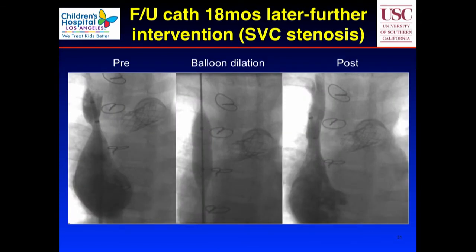Another patient with an SVC now. Again, you see how it's very narrowed down. This one didn't totally get obstructed, but it's narrowed. Patients like this can have a very swollen head because blood just can't get out of the head very easily. Just imagine if I put you upside down for a while. Your head wouldn't feel very good. Well, patients like that feel that way all the time because the blood can't get out of the head.